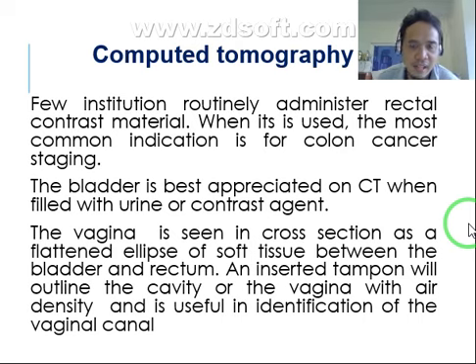Okay, administer in a rectal area. Isulod siya sa lubot. Okay, para ma-visualize ang colon. Okay, sometimes bladder, tubig na pod, or urine. Pag napuno nag-urine, highly visualized na ka ng mga stones or remnant stones and other pathologic conditions sa urinary bladder.